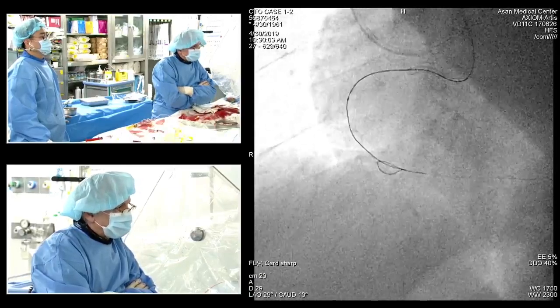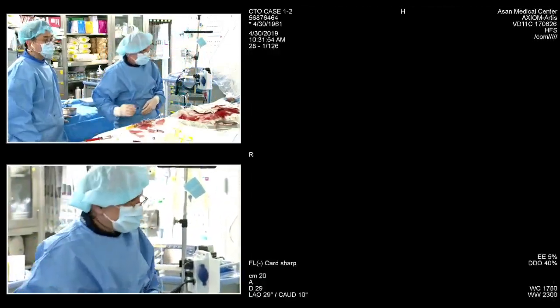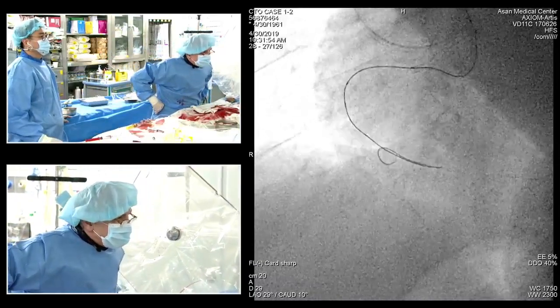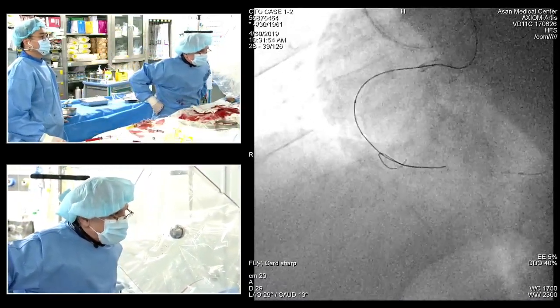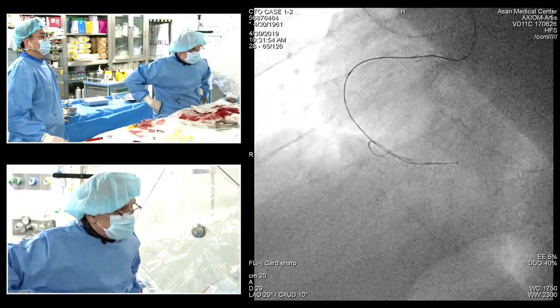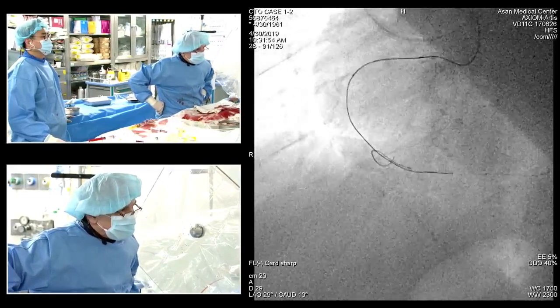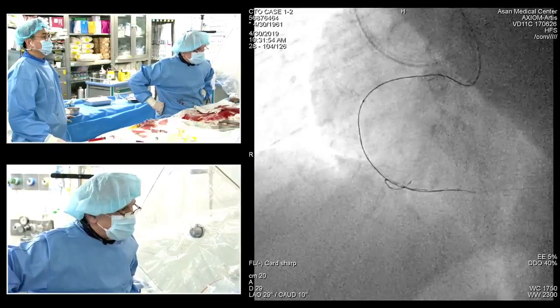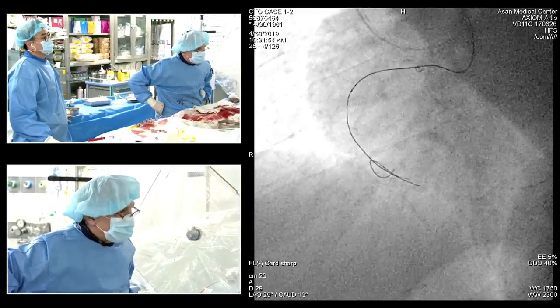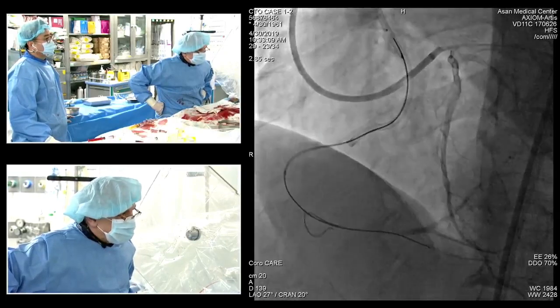And we have a wonderful target. And next. So now it felt quite good. Still resistance, we know it's a diffuse disease, a little bit too far up, but when you have a target, you can hit the target. And this now looks really overlapping. Next. So, and finally, we were indeed in this side branch.